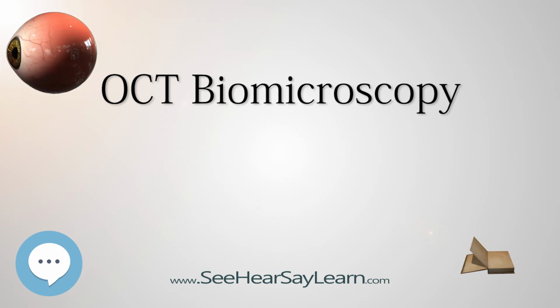Spectral domain OCT, SD-OCT. SD-OCT systems are 50-100x faster than TD-OCT systems and therefore can cover the required tissue volume for OCT biomicroscopy in a single eye in approximately 8 minutes, assuming an A-scan rate of 100 kHz. However, commercial SD-OCT systems suffer significant drops in sensitivity, and thus image quality, beyond 2 mm of penetration depth. Therefore, if used sequentially to image an eye from the cornea to the choroid, commercial SD-OCT systems would probably produce images with unacceptably inconsistent quality across the depth of the eye.